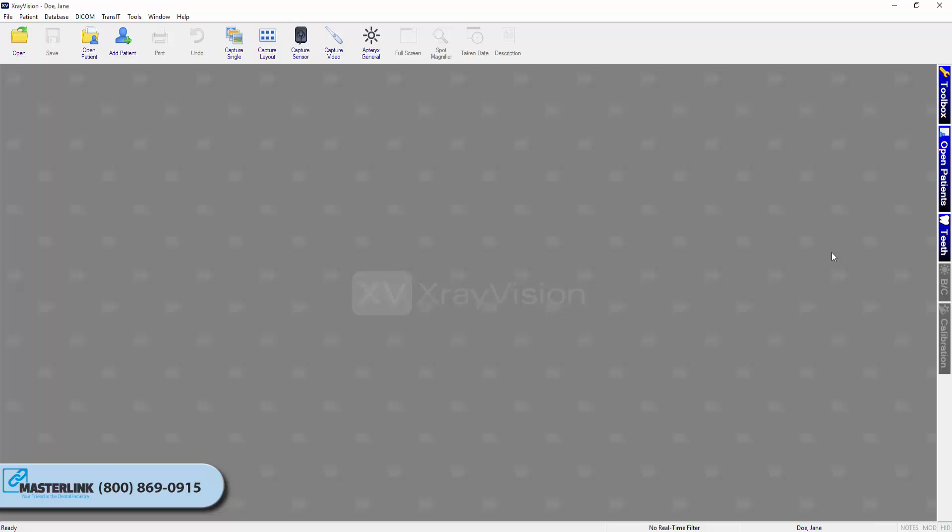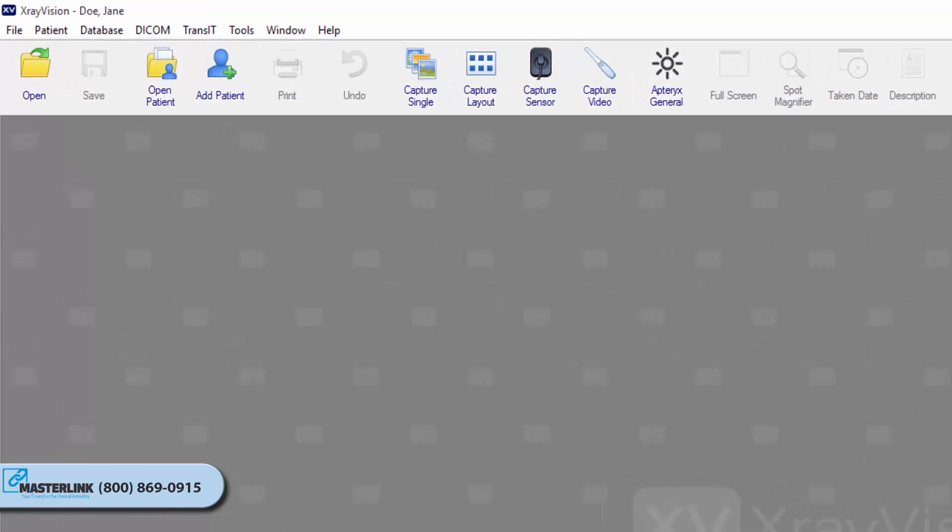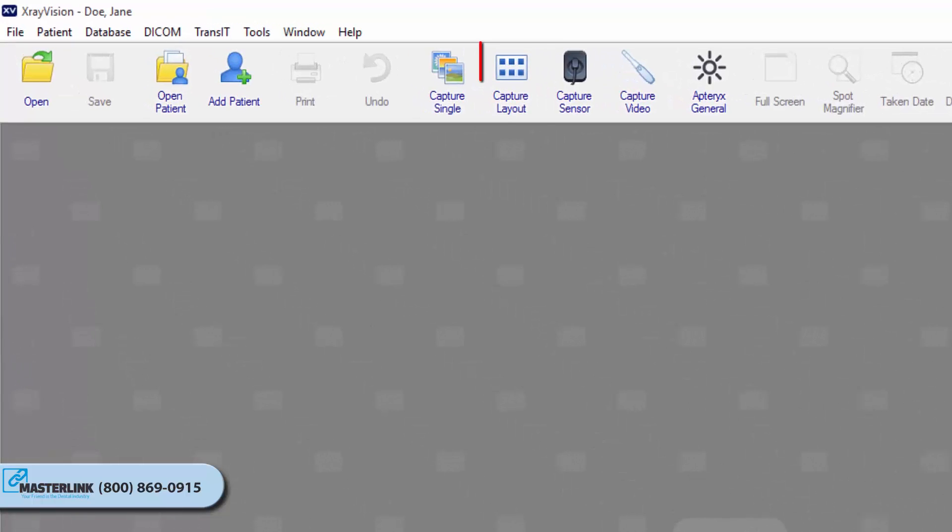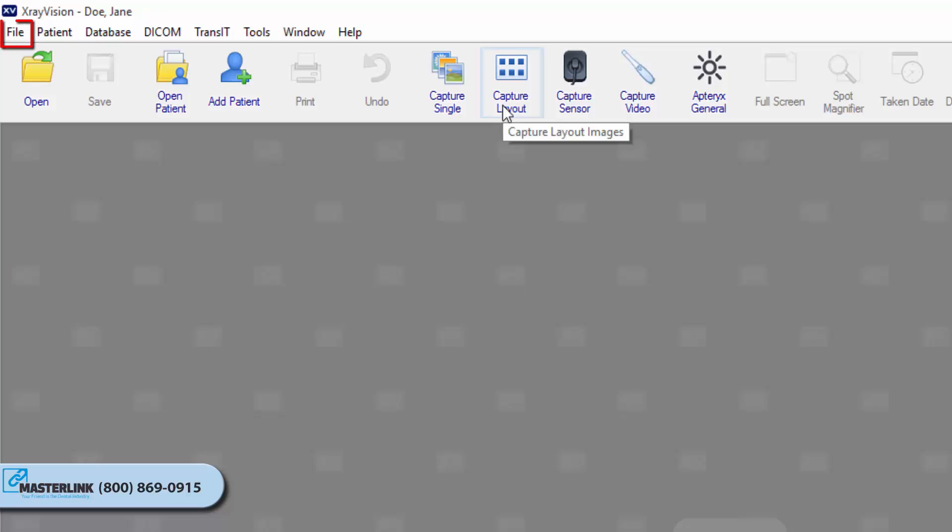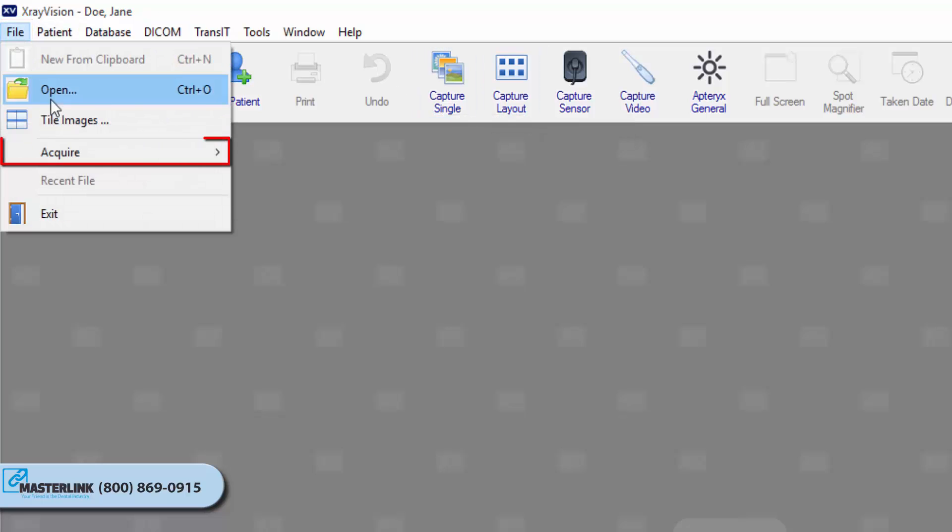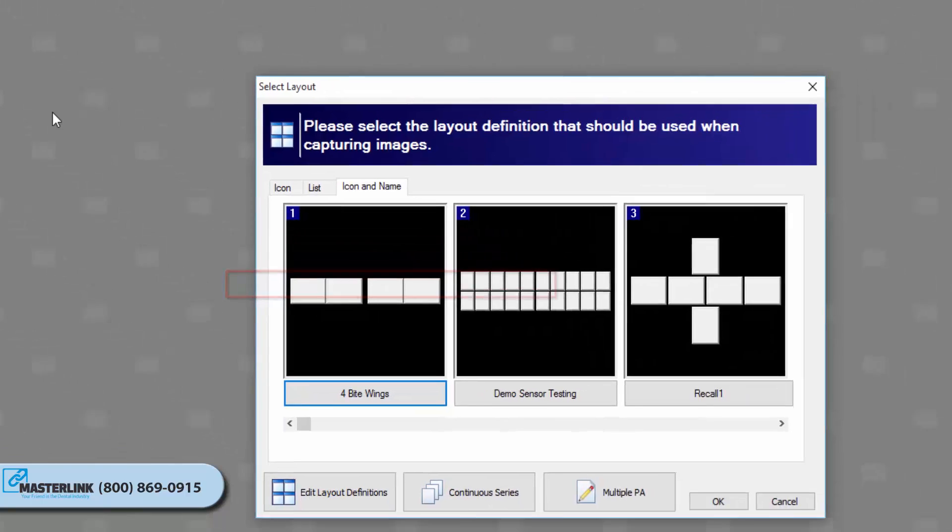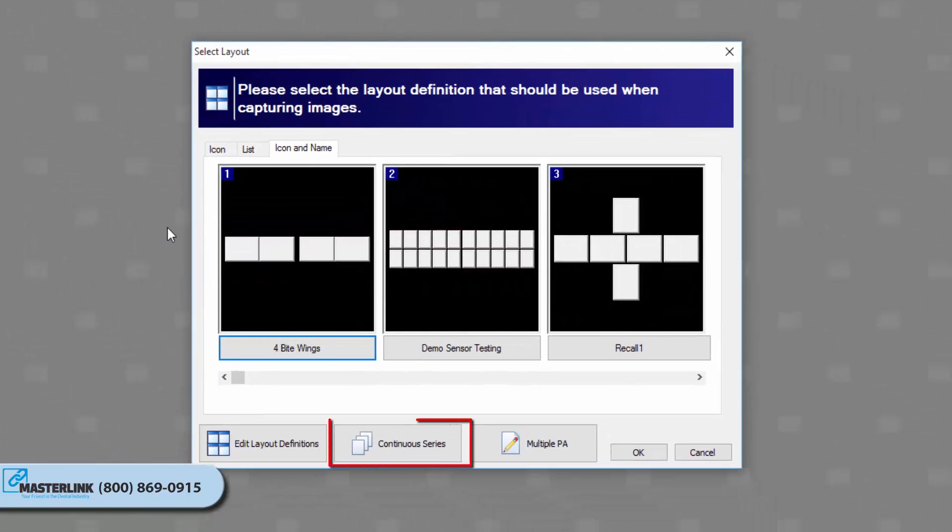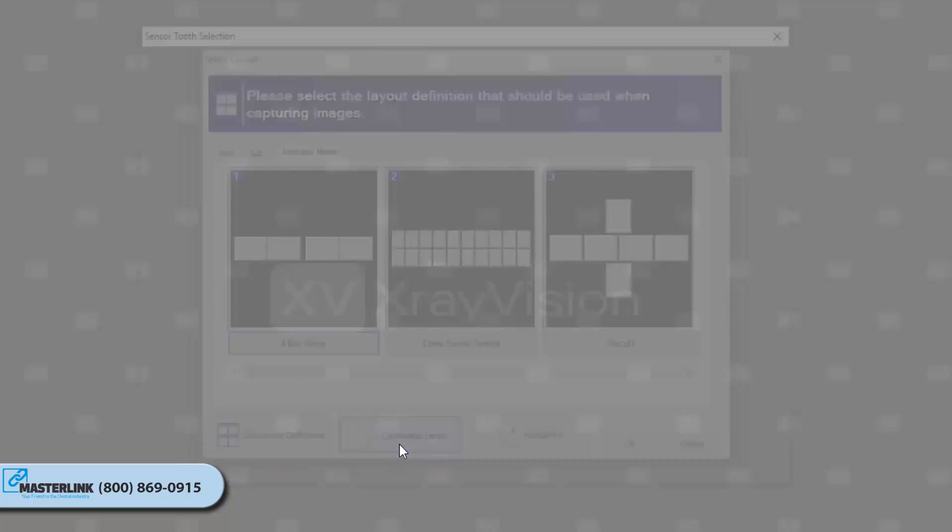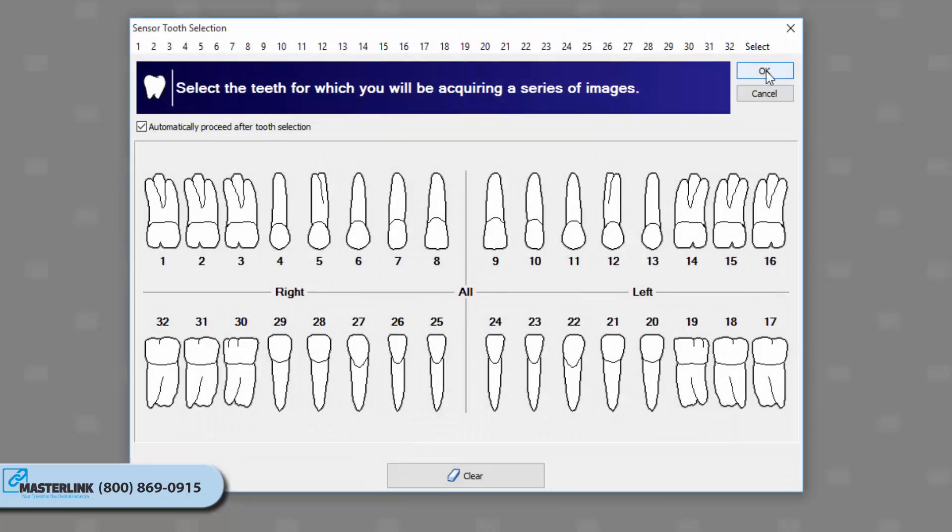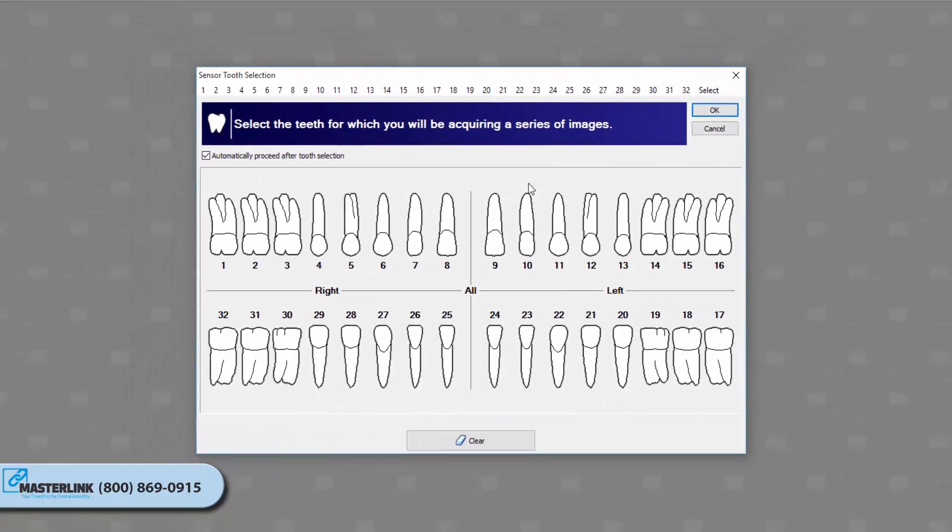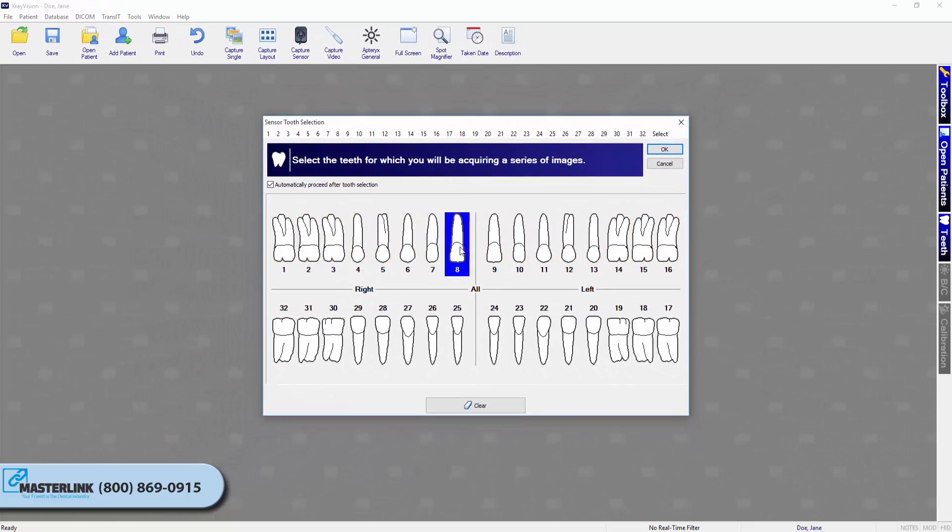To initiate a Continuous Series Capture, click the Capture Layout button on the toolbar, or select File, Acquire, Capture Layout Images. The Select Layout window will appear. Click the Continuous Series button at the bottom of the window. Select the tooth or teeth that you wish to focus on during the Continuous Capture.